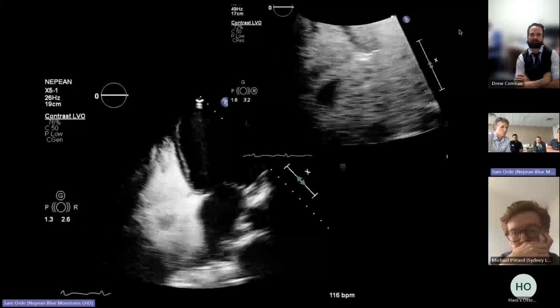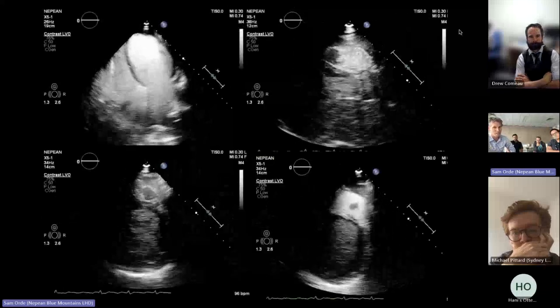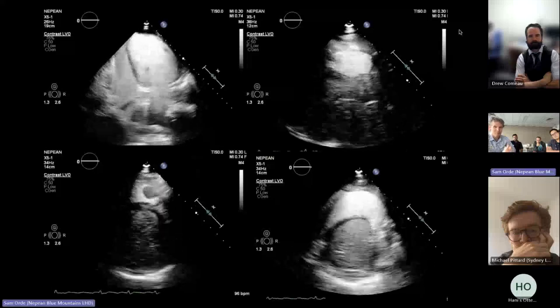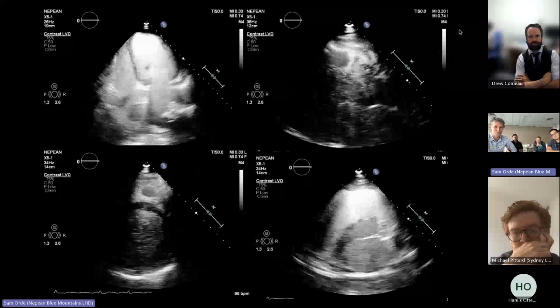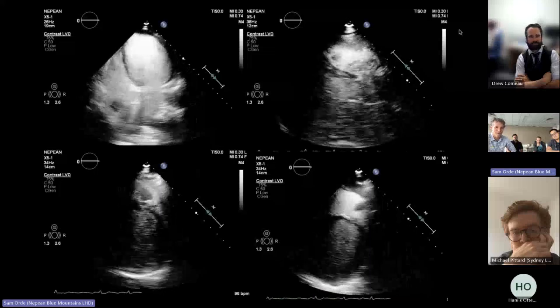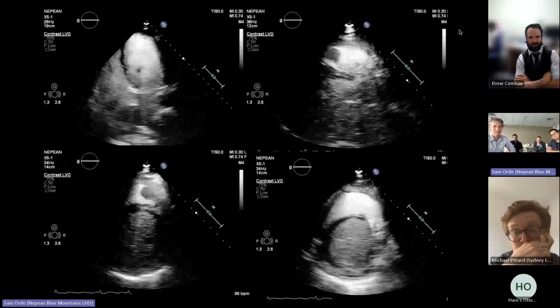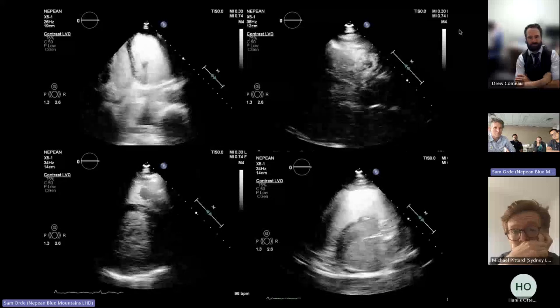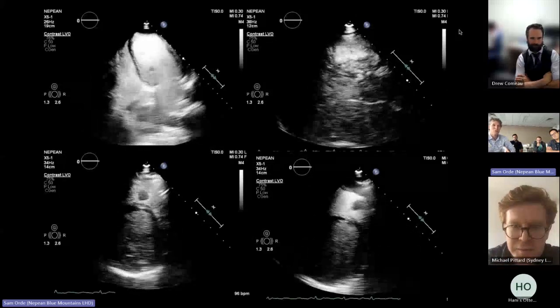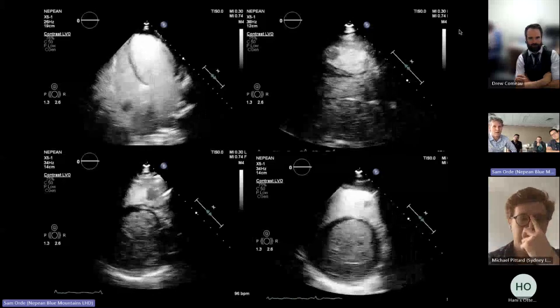And this lady's got thrombus on top of thrombus. So whatever you do, don't stop the anticoagulation that's not heparin. What was interesting though about this is that we found more clots, and what we'd missed on some of the first imaging was the massive apical right ventricle thrombus that was flicking around in her heart as well. So this lady had multiple thrombi sitting in the right ventricle. In terms of the left ventricle, we were able to look at that and come to the conclusion that was a papillary muscle rather than a nasty mass.